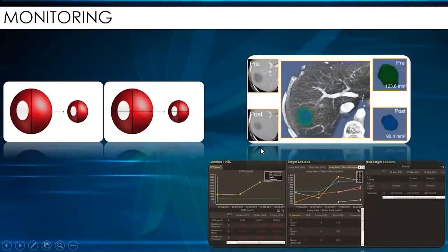There exist, again, a lot of software that are able to measure, recognizing the lesion and offering us also the overall volume. Moreover, the software are really able not only to recognize the lesion, but also to follow up the lesion in an automated manner and offer us several kinds of response according to each focal liver lesion or according to the specific criteria that we use.